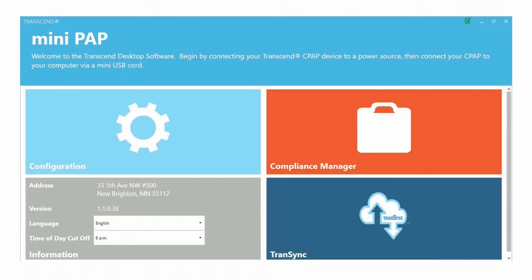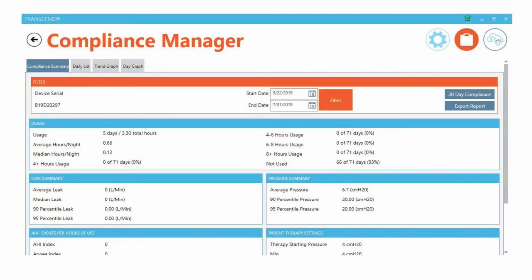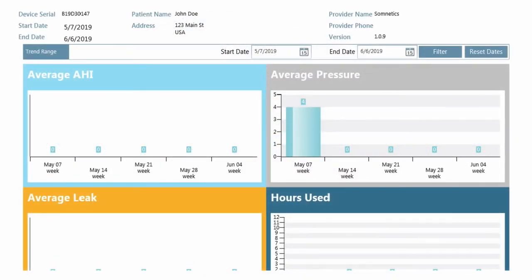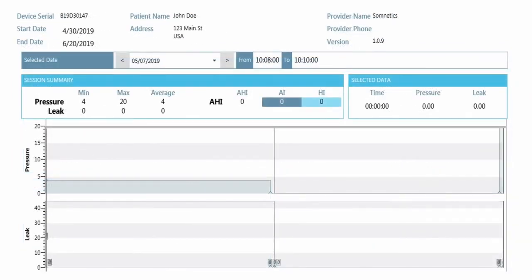The free Transcend software lets you view your compliance data and adjust the comfort features on your CPAP. Visit www.mytranscend.com/support to download the software to your computer. Connect your Mini CPAP to power, then to a computer with the included Mini USB cord to download compliance data or adjust your comfort settings.